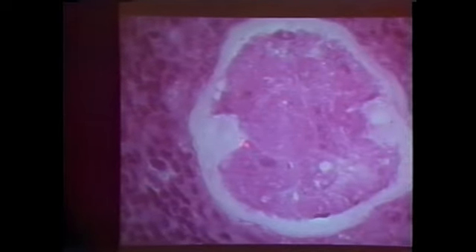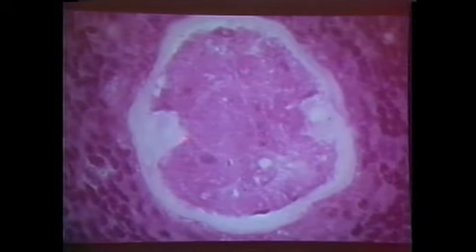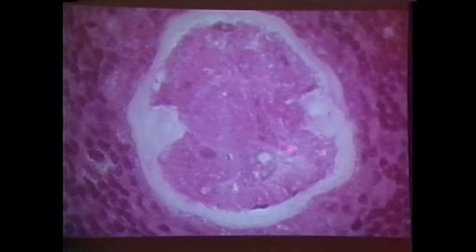But look at this case. I mean, this is a tough diagnosis, people. But this is a uterus, by the way. Excuse me. And yeah, a uterus here. There was a uterus here, and this was the intestine. Can hardly tell. But look at those lateral internal ridges. And it had a smooth cuticle. So these are your Dirofilaria.